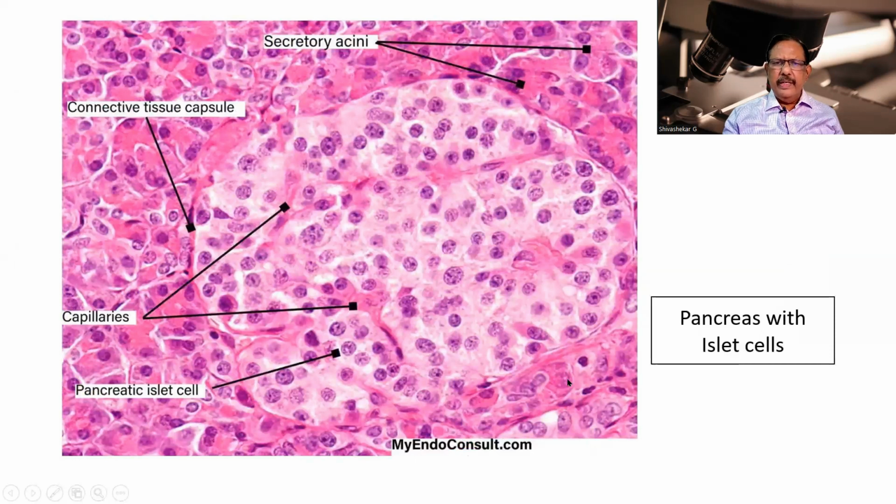And this itself is the islet cells. Islet cells, as I told you, are pale. It is an endocrine organ. An endocrine organ will be having a uniform appearance, somewhat uniform, organoid appearance. See, when you see one region, you need not see another. And the catch is there won't be any ductule or duct. It directly empties into the blood. The capillaries, for example, that is where all the secretions are being emptied. So this is the islet of Langerhans.